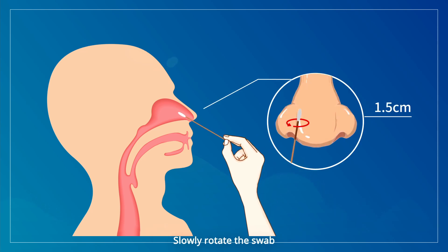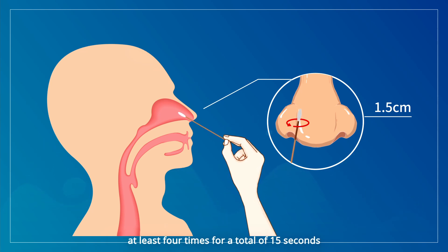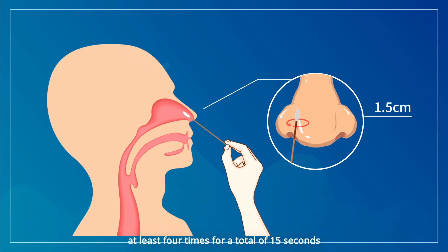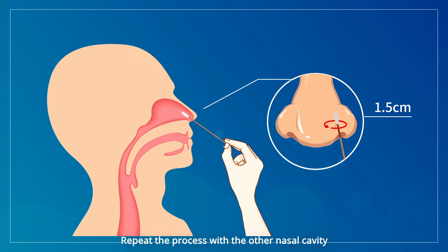Slowly rotate the swab in a circular path against the inside of your nostril at least 4 times for a total of 15 seconds. Then remove it from the nostril. Repeat the process with the other nasal cavity using the same swab.